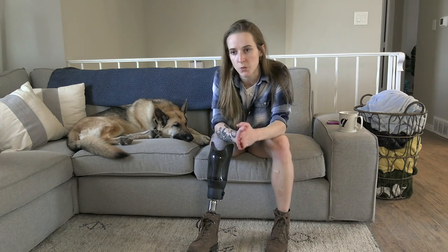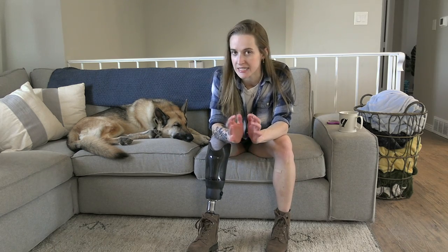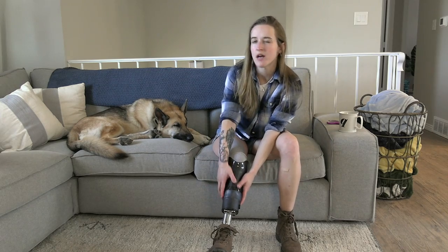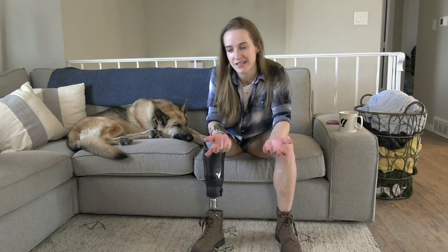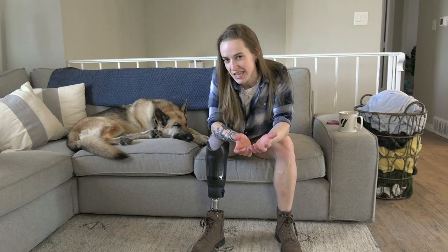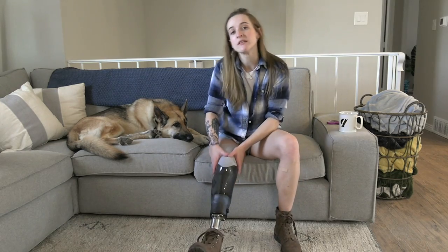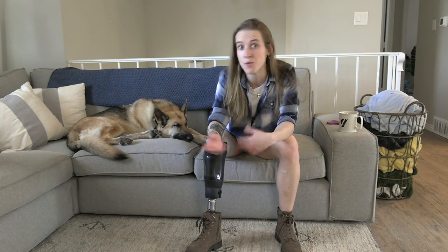I don't think that I would wear this running or doing any kind of high impact activities, at least yet. It still feels kind of weird not to have as much contact with the rest of my leg. It feels like it could come off easily, even though it's not going to. I don't quite trust it yet, I think. And I know a lot of people who use pinlock sockets who do still wear a sleeve for additional support when they're doing high impact activities like running, snowboarding, things like that.